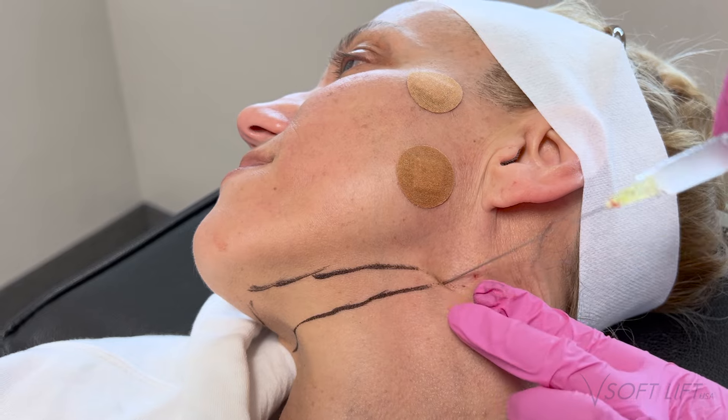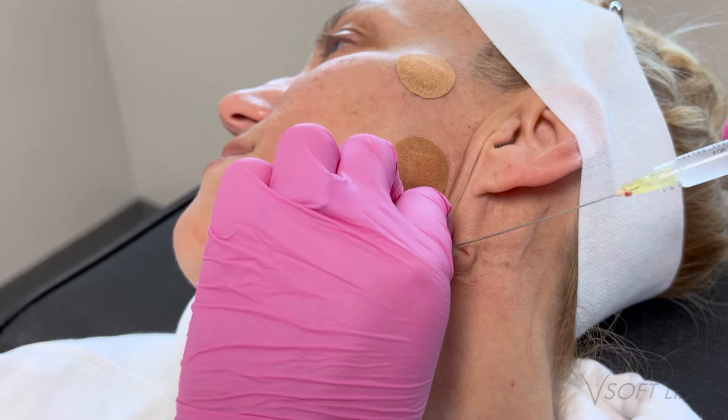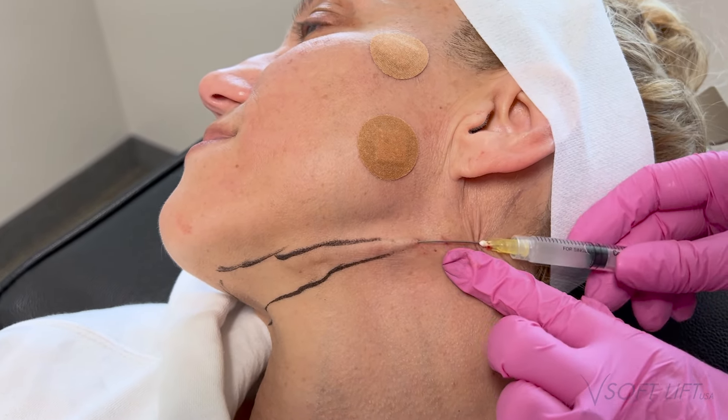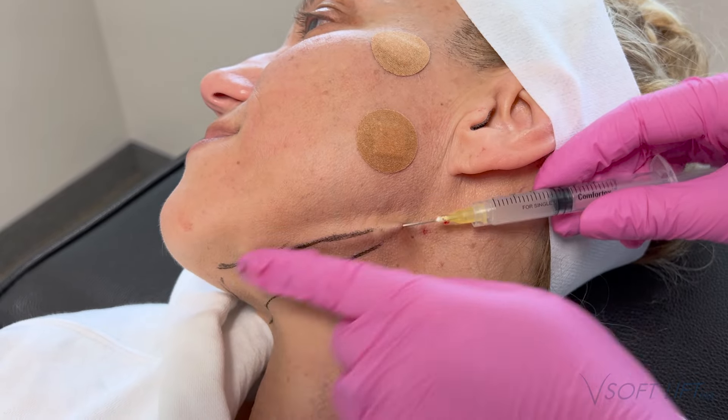I go over the area with an alcohol wipe to clean her up, then place a band-aid. I have the patient leave these band-aids on for the rest of the day — until they're home and done with their work day — just to keep the initial insertion site clean. Then they can take it off that night.